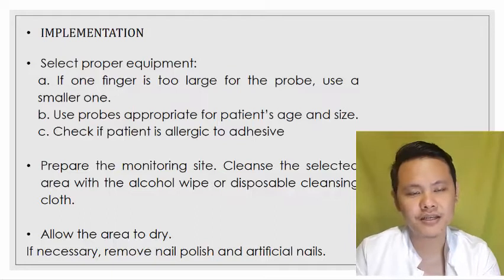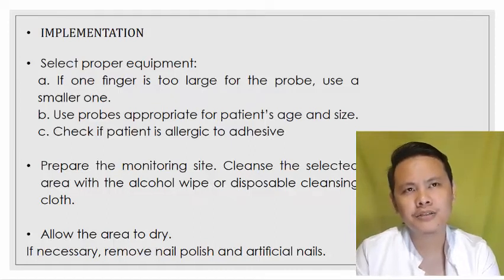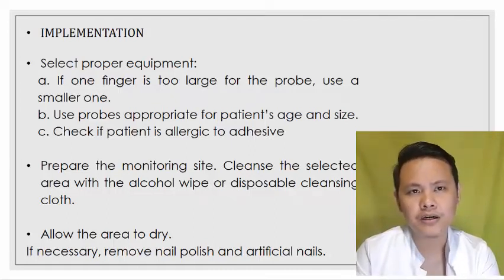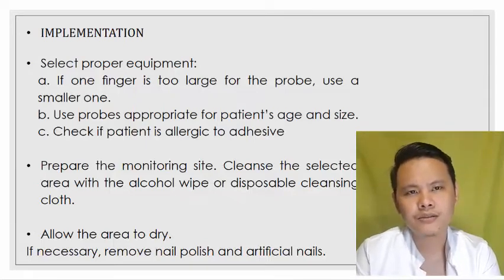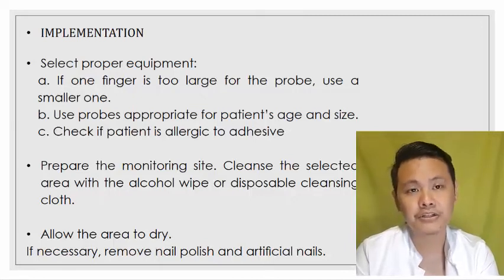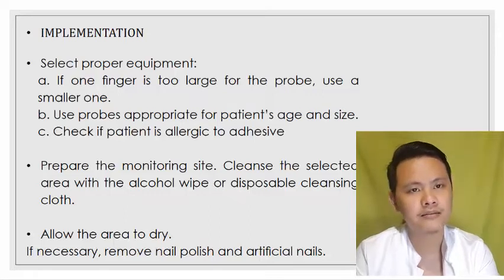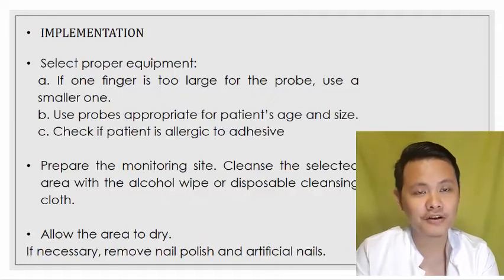Next, check if patient is allergic to adhesive. Bakit? Kasi some other pulse oximeter and also sensor, they require to be stick with adhesive tape. Okay, para sa ganun, hindi malaglag. So, kung ang pasyente natin is may allergy sa mga adhesive tape, then that will be a problem. May magkakausa ng irritation. Next, prepare the monitoring site.